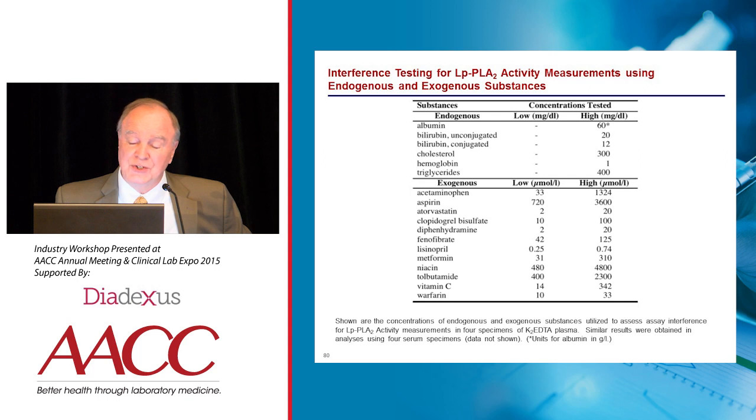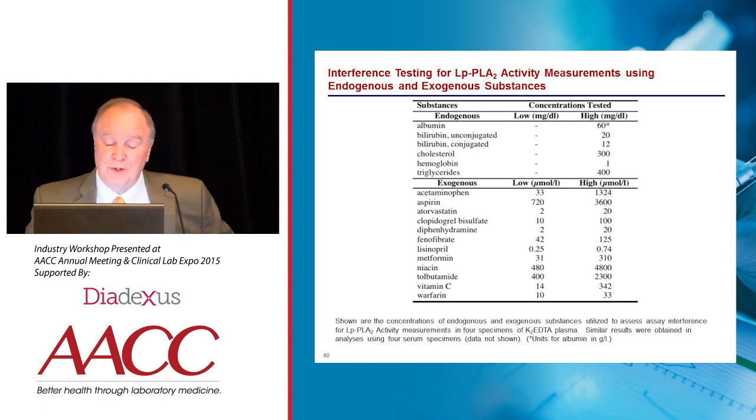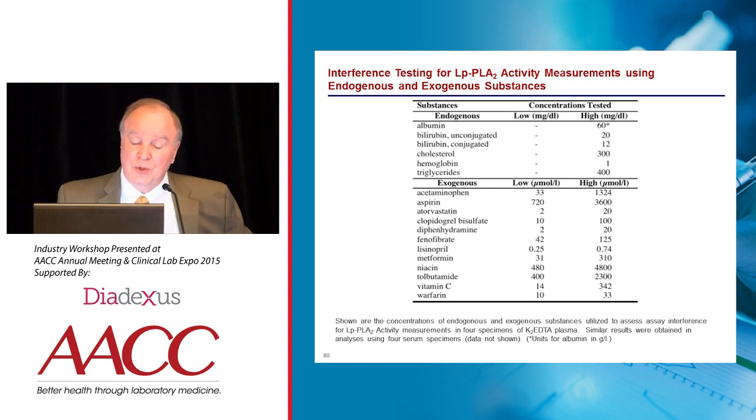Looking for endogenous interferences, we've tested that, and this is, again, going to be published. We're seeing very few interferences from the typical things we suspect for this kind of assay. And then, of course, the exogenous interferences from drugs that we worry about, we've tested some of the more common drugs here and are not seeing any interferences at these levels. So very, very robust. And as you can see, it's an assay that we can perform in a variety of different laboratories and in different environments.